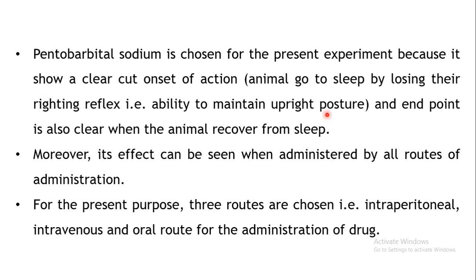Also it shows a clear-cut end point. When the animal recovers from the sleep, it shows the righting reflex again and will quickly correct its position. So it's very easy to identify very clearly the onset of action and the recovery from sleep, and to note down for how long it is sleeping. Also, this effect, loss of righting reflex, is shown when this drug is administered by all routes.